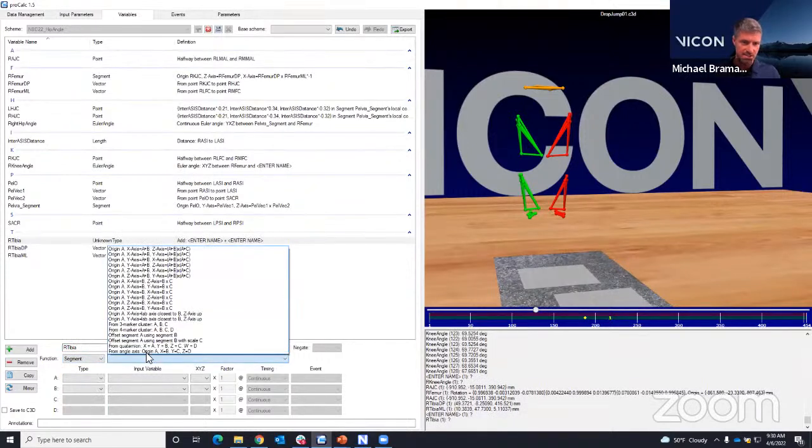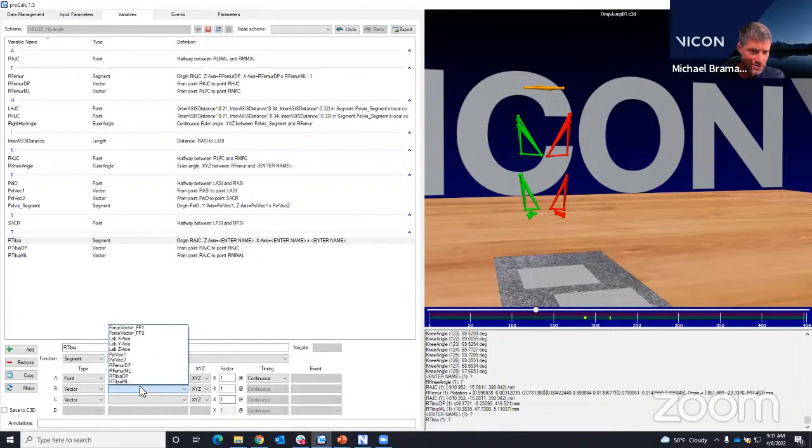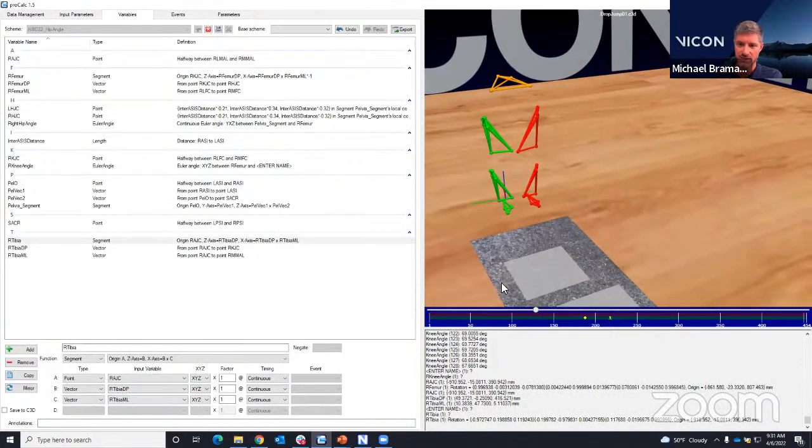segment. These first options are if I were just specifying points, and it would create those vectors for me. Since I've already created the vectors, I'm just going to go right down here. The first entry is going to be the origin marker. Then I can choose whether my next vector is the X, Y, or Z, and I'm going to start with the Z, the distal proximal vector. So Z-axis is B, and then X-axis is going to be B crossed with C. I'll select that right ankle joint center, and then choose those vectors: right tibia distal proximal, and then my medial lateral vector. Now you can see that I've got a segment created.